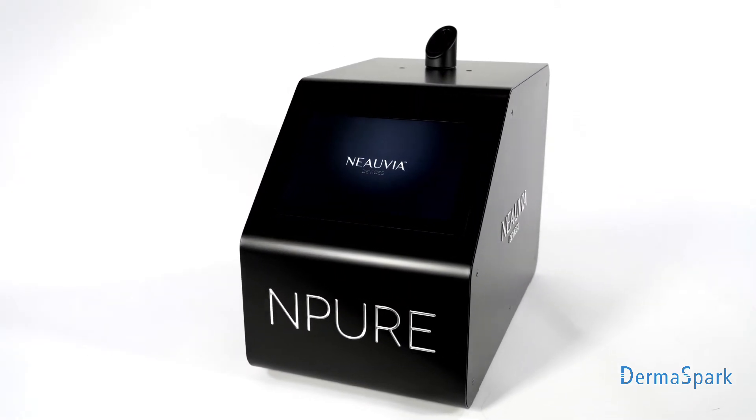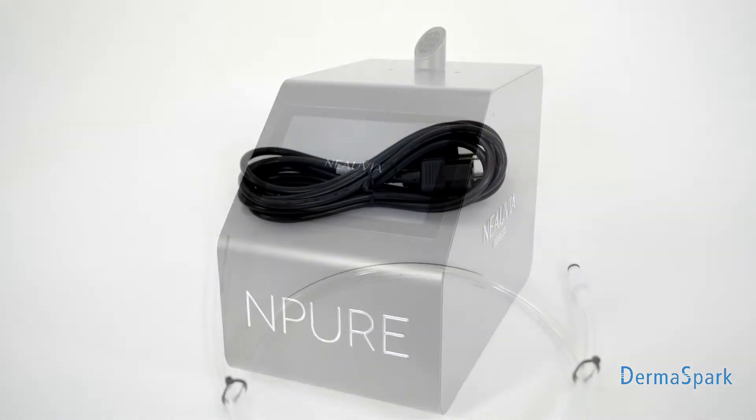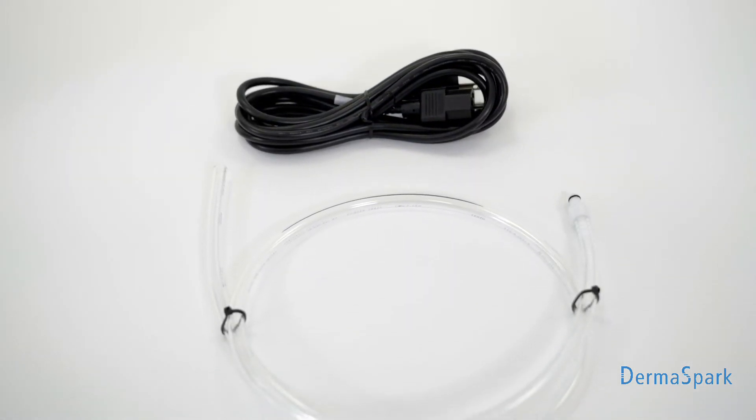The basic system includes the N-Pure device, power cord, and refilling tube.